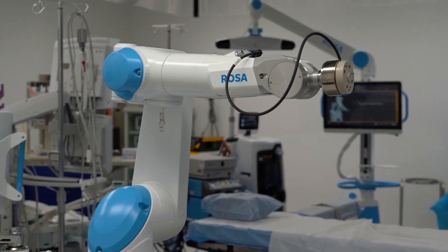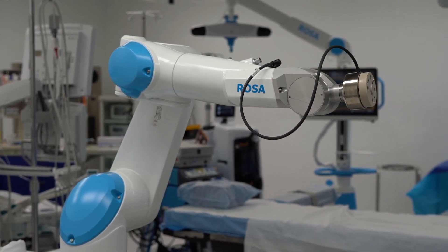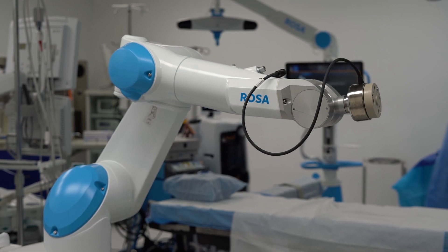We are actually doing the surgery — we just use the robot to assist us, basically to measure things out and make things more precise. We do the cutting and all the hard work. The ROSA is really just used for the calculations. I do the entire procedure; the robot is just an assistant to me in getting the components where they need to go, but I'm actually doing the procedure the entire time.